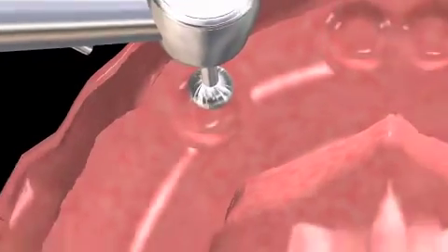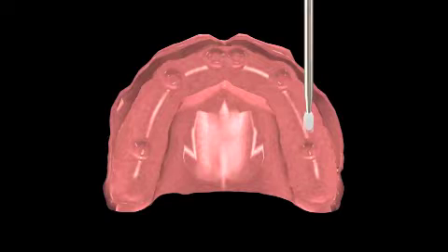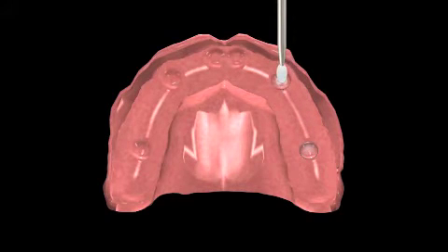Prepare a recess in the denture over each metal jacket. Use Stern Vantage Varnish to prime the recesses over the metal jackets and light cure.